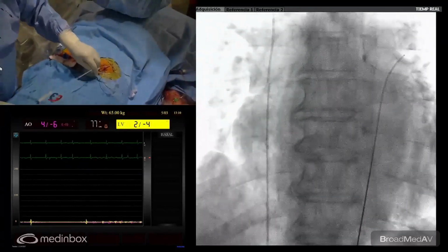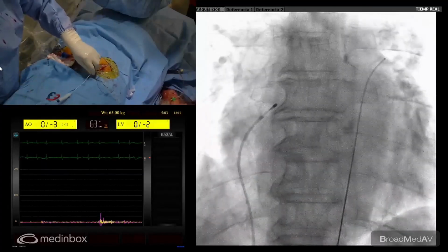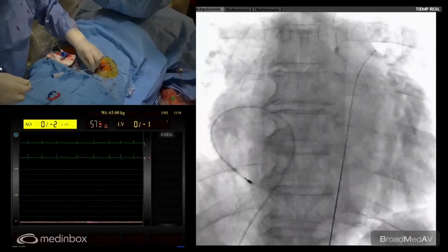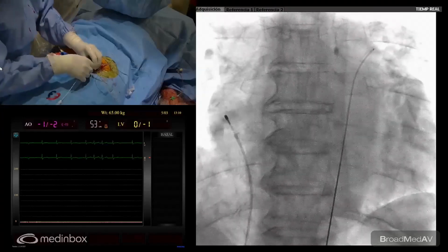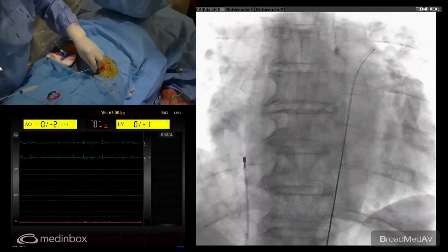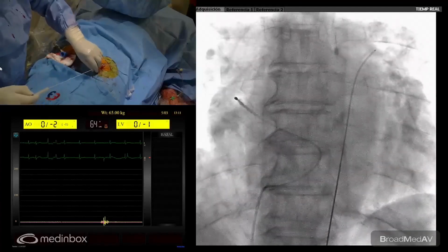So this case is from the beginning, just to use all the time we have this hour, because if not, this is the most difficult part in a TAVI procedure, to put the pacing wire in the right position. Especially for patients with tricuspid regurgitation, sometimes it's difficult. These wires are okay because they are soft, but a little bit difficult to manipulate.